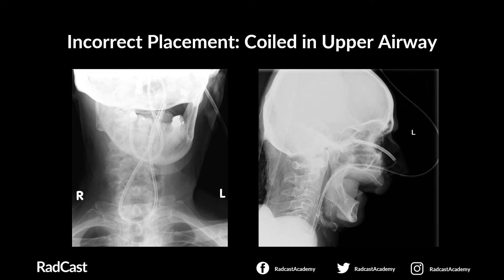This slide demonstrates that an NG tube can become coiled in the upper airway, so if you don't see an NG tube on the chest x-ray, this is something to consider.